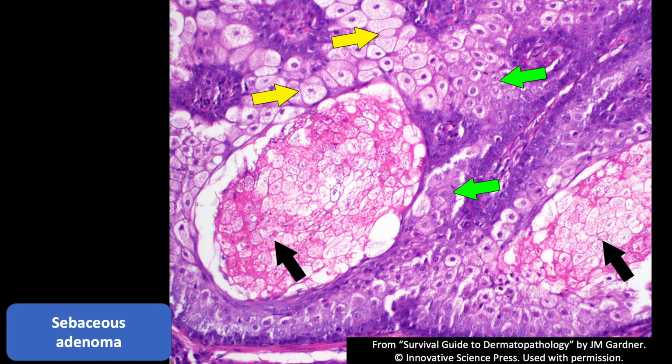And if I have a transected shave biopsy and can't see the base, and I have some unusual or atypical feature, then I'll say a sebaceous neoplasm with atypia, and then put a comment that I think it's probably sebaceous adenoma, but I can't see the bottom, and it might be a good idea to do a conservative excision so I can see the whole lesion. I don't otherwise think personally that sebaceous adenomas or sebaceomas must have to be excised with negative margins. Some people have different views on that, but my thought is that they're probably just fine and they're benign. The only time I really usually ask for excision is if I can't see the whole lesion and I have some concerning feature there that worries me that maybe we're on the top of something more aggressive like a sebaceous carcinoma.